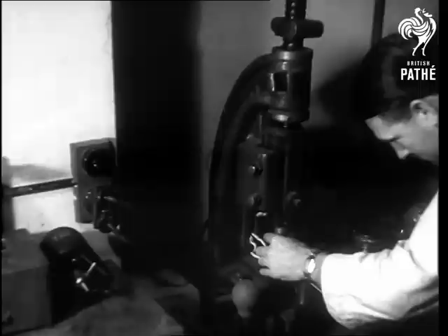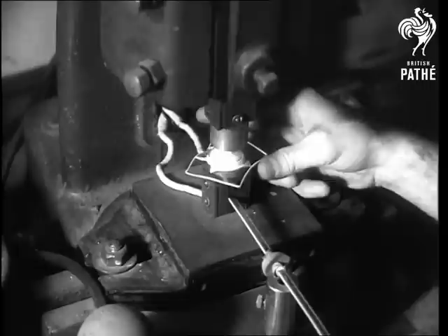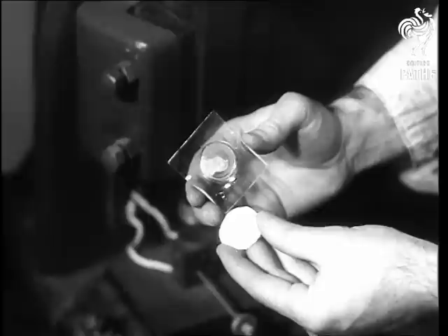Now the cast is put into a press and the plastic lens itself is molded. The lens is shaped to fit its wearer's eye and also to give the same visual correction or aid that would be given by normal glasses. Now the lens is cut to shape from the plastic square and it's ready for grinding.